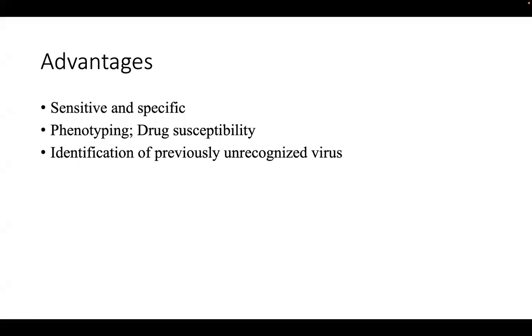And what are some of the advantages of using cell cultures? Cell cultures are very sensitive and specific. And since you're growing the virus, you have so many viral copies, you can use those for phenotyping and drug susceptibility. Unlike other techniques like PCR, where you don't have the live virus to probably do phenotyping or drug susceptibility. And they're also used for identification of those viruses that are not yet known, that are unrecognized.